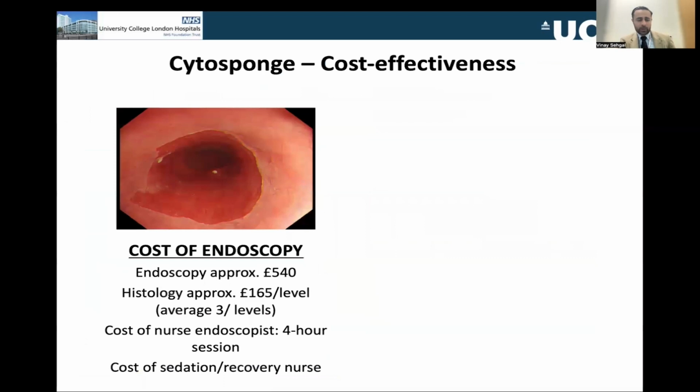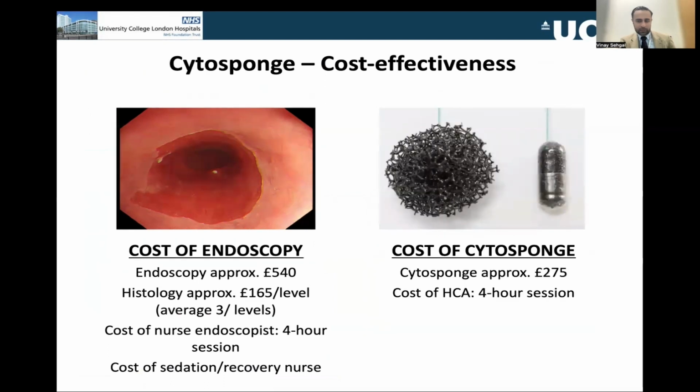Cost is important, and we know that in the UK, the cost of an endoscopy is not insignificant. So when we add up the cost for an endoscopy, followed by each level of biopsies, which on average are 3 separate pots, and then the cost of your operator personnel and sedation, that is significantly in excess of that of the cytosponge, which can be performed outside of an endoscopy unit. It doesn't require sedation, and it can be performed by a healthcare professional that need not be a nurse or a doctor.